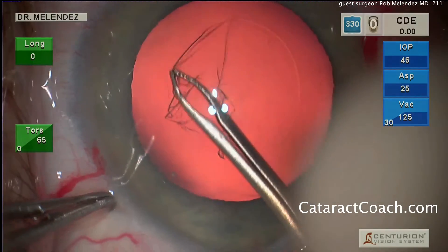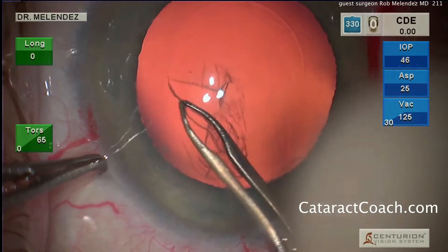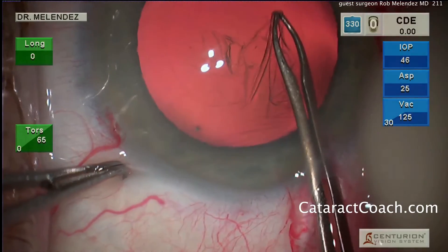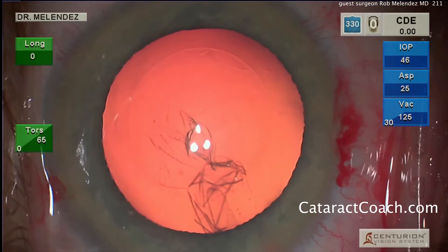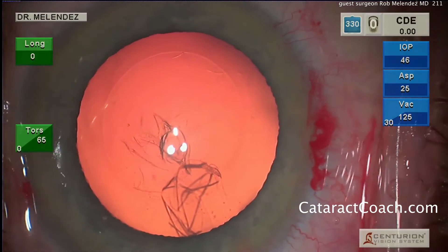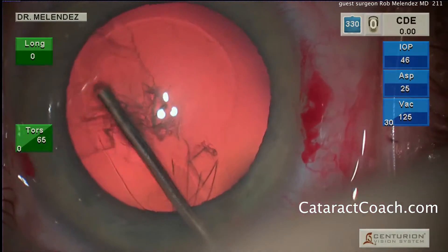He's doing it in a counterclockwise manner, making it nice and round with about a 5-millimeter diameter. That looks just about perfect. Dr. Melendez has been in practice for coming on 20 years and has done tens of thousands of cataracts — he's certainly a very accomplished surgeon.